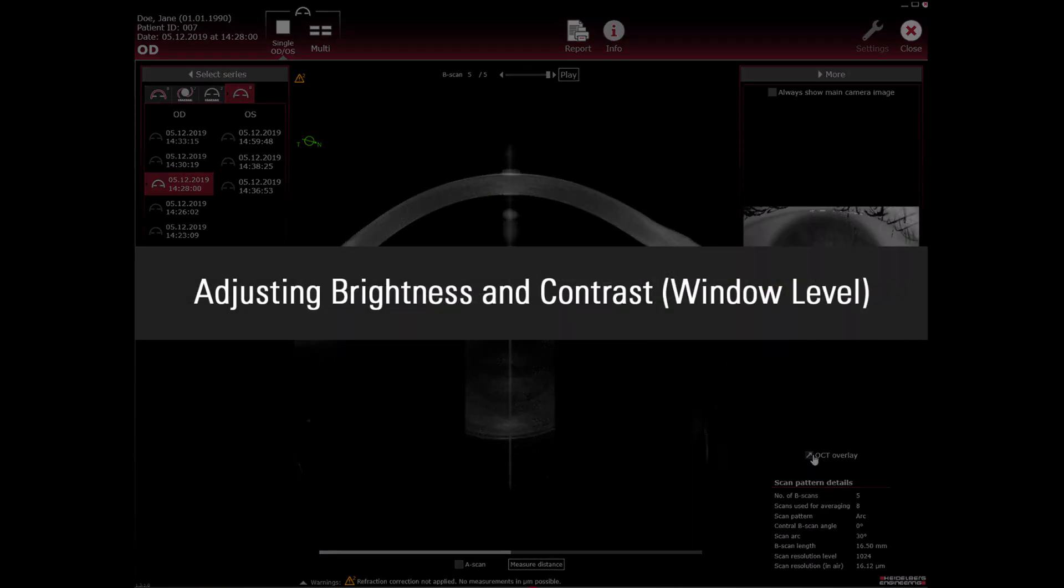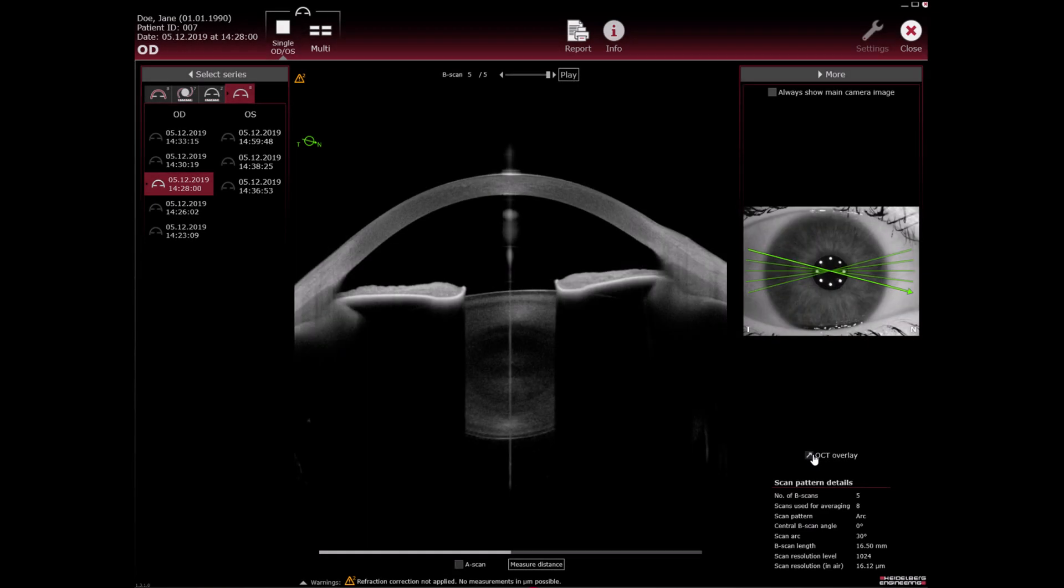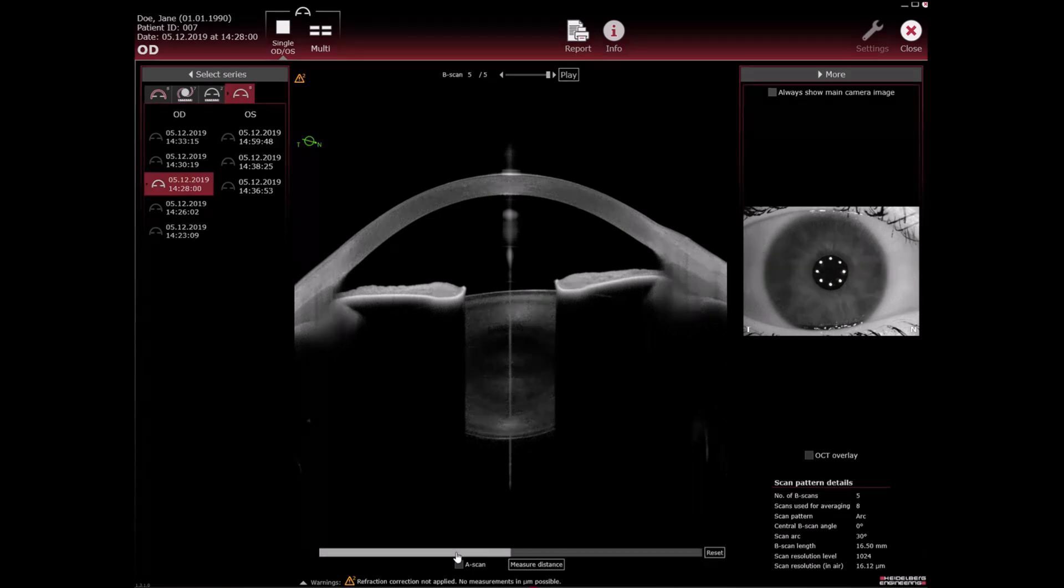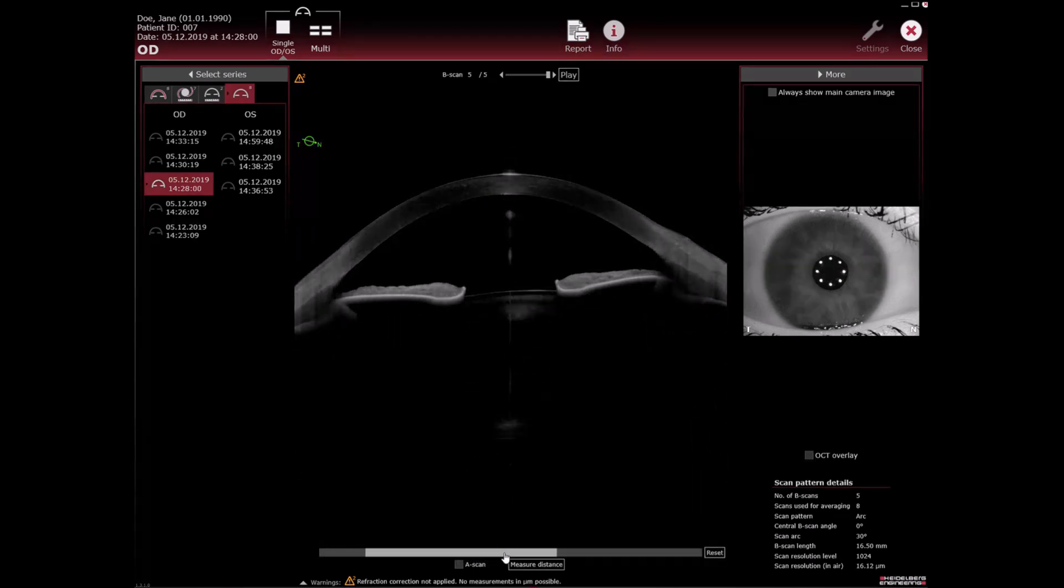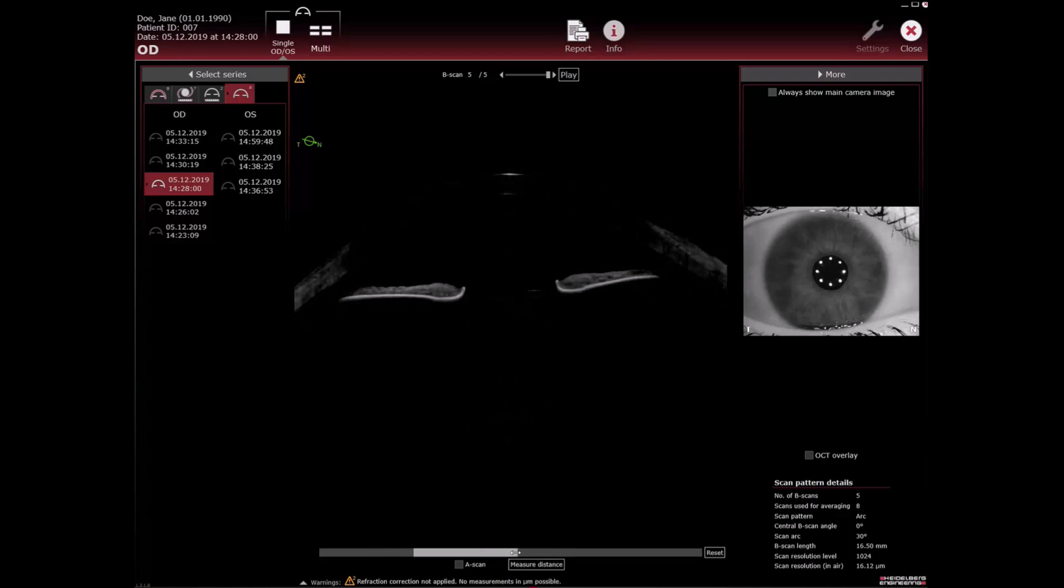Adjusting brightness and contrast window level: You can use the slider below the OCT section image to adjust the image brightness and contrast. Drag and drop the slider to the desired position and increase or decrease the image brightness and contrast.